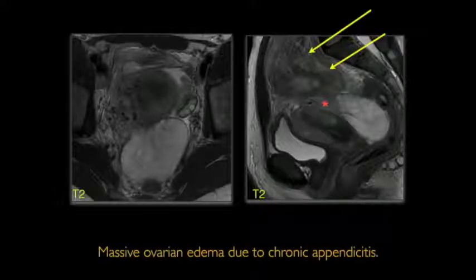We did see the ovarian edema, but what we found was a subacute appendicitis. The appendix had been inflamed and was dripping down to the ovarian pedicle and basically caused that to become edematous and twist off the lymphatics and the veins. I mean, obviously, it's a totally unusual case, but it happens. So they went back in, did the surgery with the general surgeons and GYNs, and they actually managed the ovary expectantly because once the inflammation went away, the ovary size decreased.